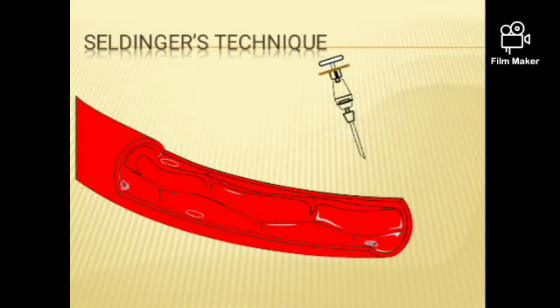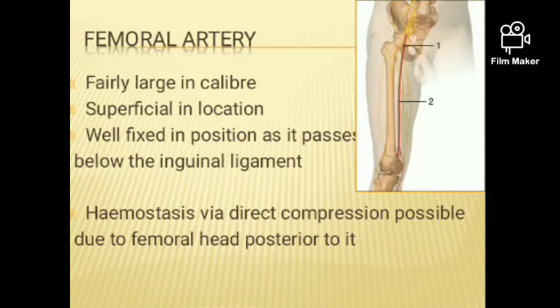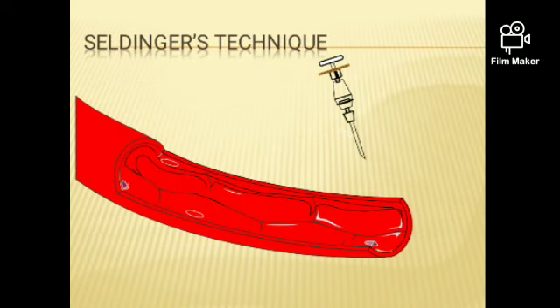So this is how we do the angiographic procedure. For the angiographic procedure we require a technique known as the Seldinger technique, invented by Dr. Sven Ivar Seldinger in 1953, and that technique became famous for angiographic purposes. Let's move on to the technique. First, we have to select the area and which side we are going to use. We are going to select mainly the femoral area.